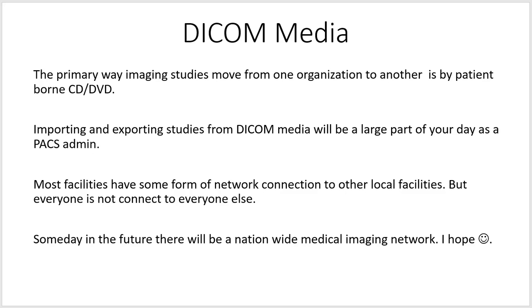Most facilities have some form of network connection to other local facilities. So the two Lancaster hospitals may have a DICOM connection to move images back and forth, but if you need to take your images to CHOP, Children's Hospital of Philadelphia, they're not going to have a network for that. And everyone is just not connected to everyone else. That's why we end up using CDs. Someday in the future, there will be a nationwide medical imaging network. I hope.